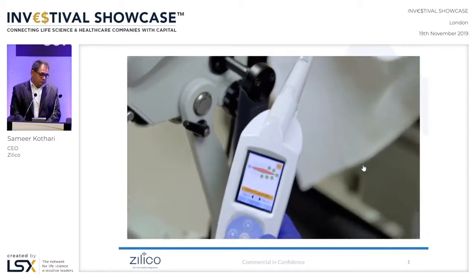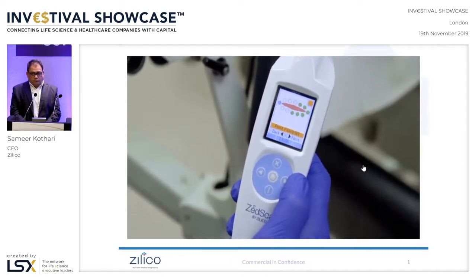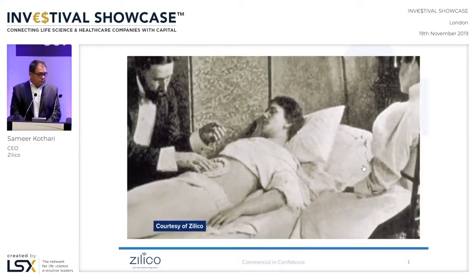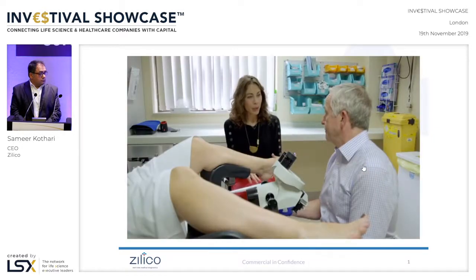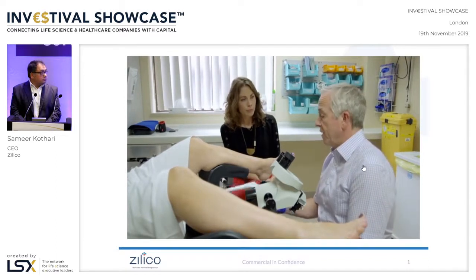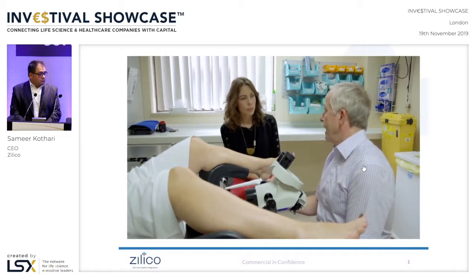Zilico's EIS technology is proving to be hugely beneficial when it comes to the cervical screening pathway. The traditional colposcopy method hasn't significantly improved since the 1920s, but Z-Scan is changing this. So talk to me a little bit about the process then. Okay, so once we've passed the speculum, we apply the acetic acid. While that's working, I use Z-Scan. It takes 12 measurements from around the neck of the womb. It surveys the area where the precancer may be.